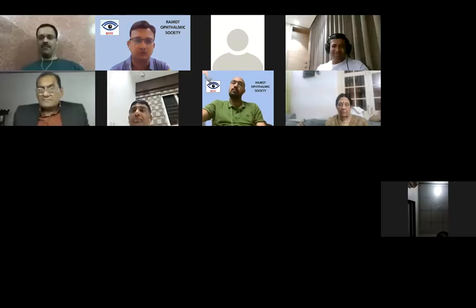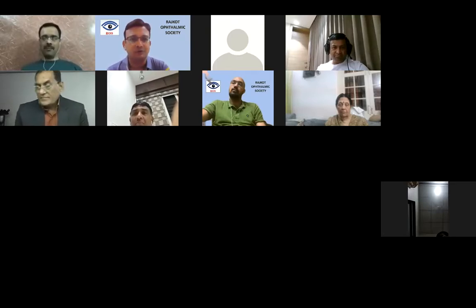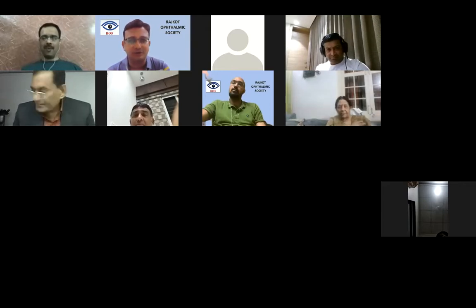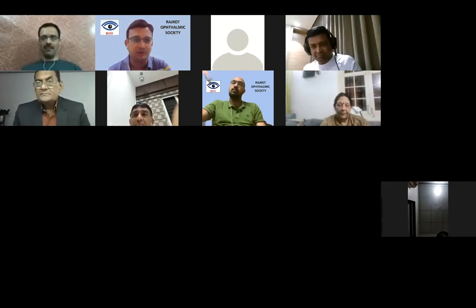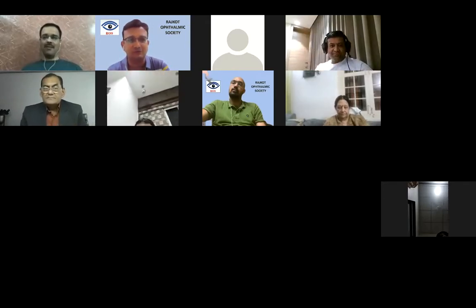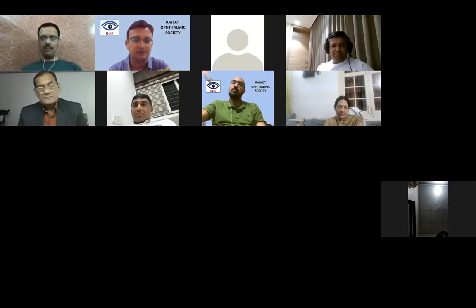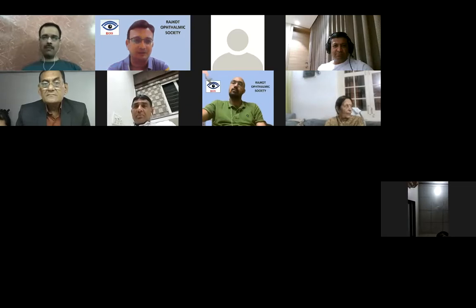Thank you, Dr. Dhruv. Excellent surgery and excellent recording. We could see all the folds and the cauliflower retina first, the mulberry appearance, and then later on opening up, blooming up beautifully. Well done. Of course, these surgeries always have this problem of intrinsic fibrosis and redetachments and the curling up of the edges, as you said. Yes. But that doesn't stop us from trying, because a fair number remain attached and maintain useful vision.